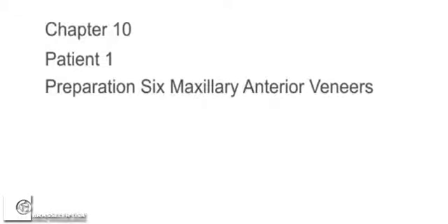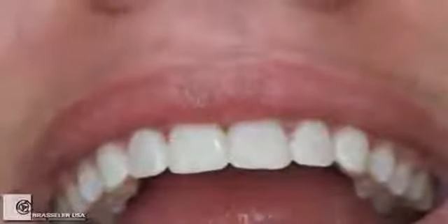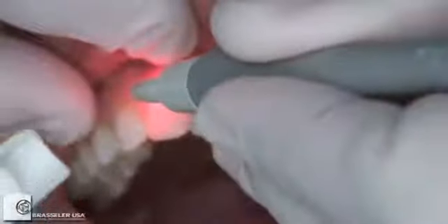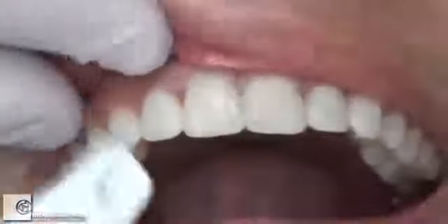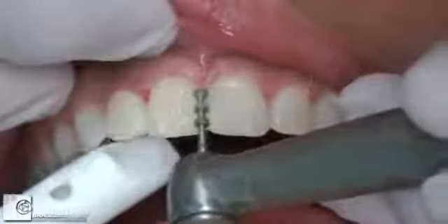Demonstration now of preparations of a relatively simple veneer case, one of the ones we did in the Bonded Functional Aesthetic prototype DVD that hopefully you've had a chance to view. We built up the composite a little bit onto the soft tissue to demonstrate to the patient what it would look like if we did a little tissue recontouring.